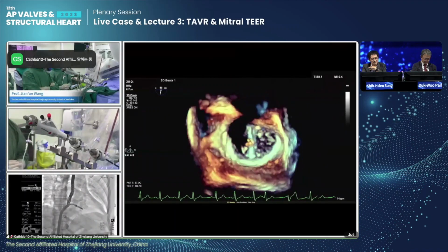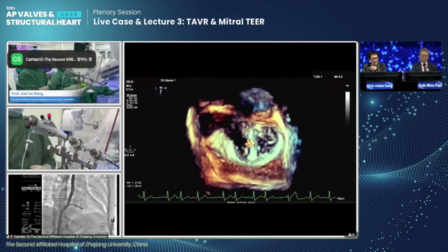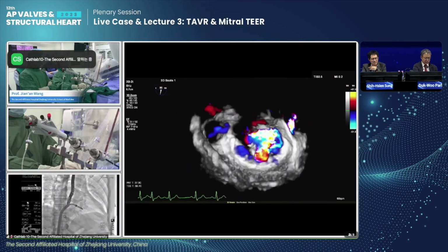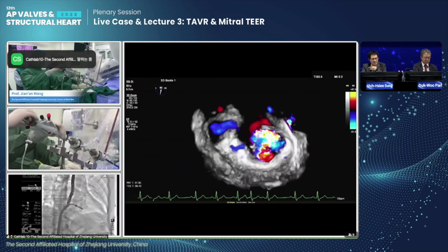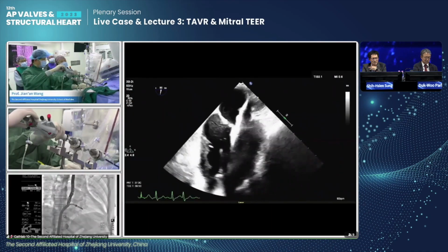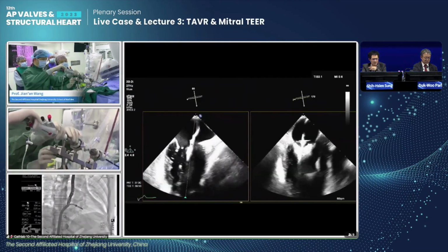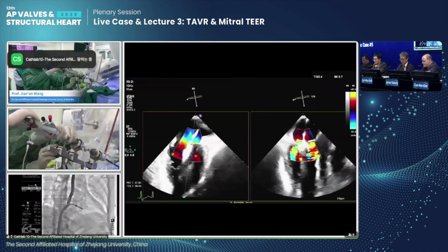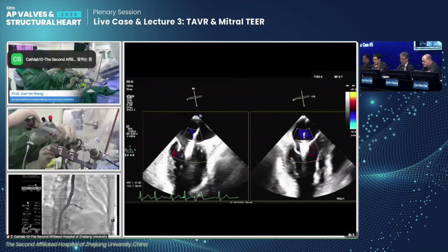So can you just close to see? Yeah, we can try. We need color. 颜色看看。Okay. So we can just try to close the two arms. We can go to 2D. Color placing. It looks like you're on the lateral aspect of the jet. Just should be at the indentation. This might be fine.